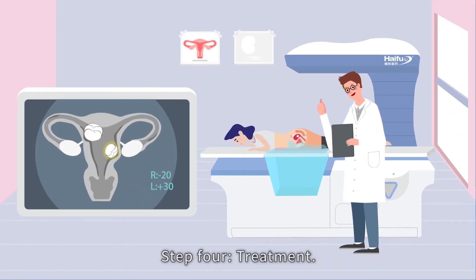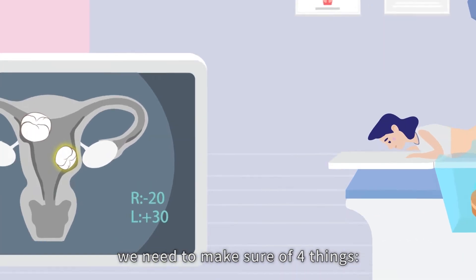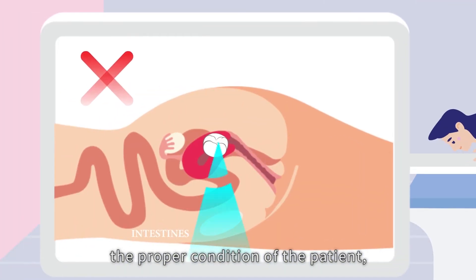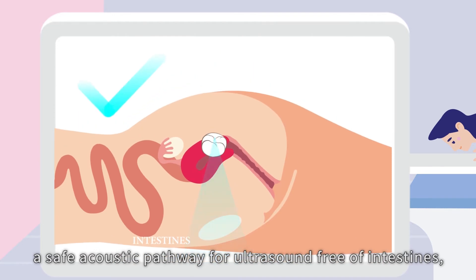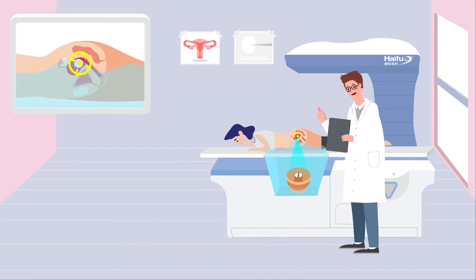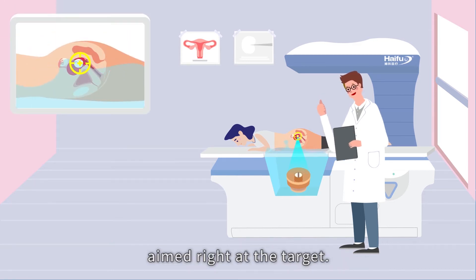Step four: treatment. Wait a minute before pulling the trigger — we need to make sure of four things: the proper condition of the patient; a safe acoustic pathway for ultrasound, free of intestines; a safe water level and temperature; and the focus point of the HIFU knife aimed right at the target.